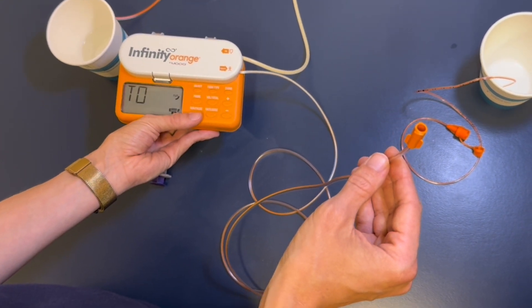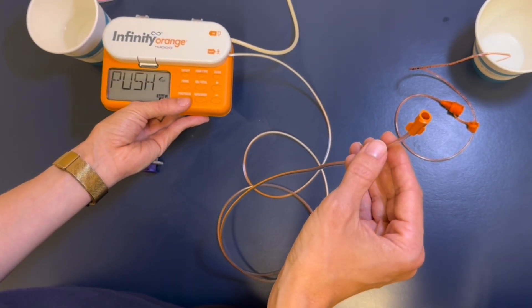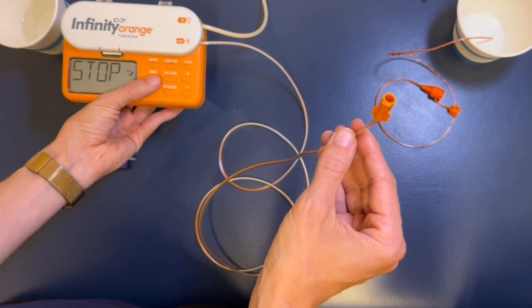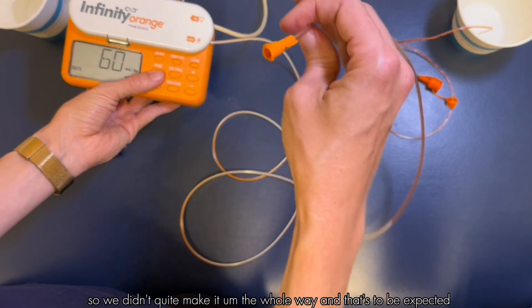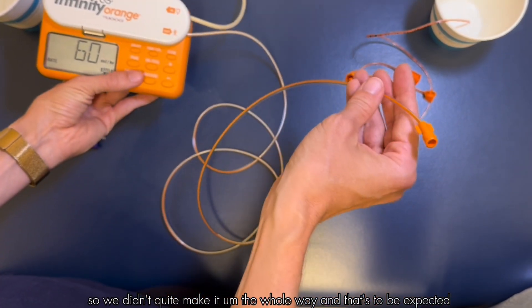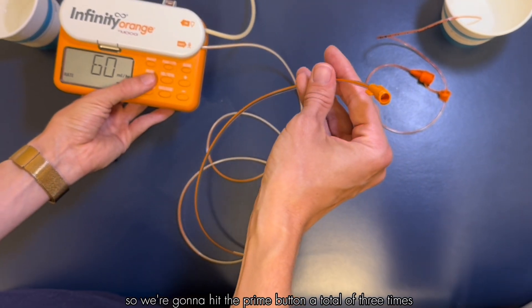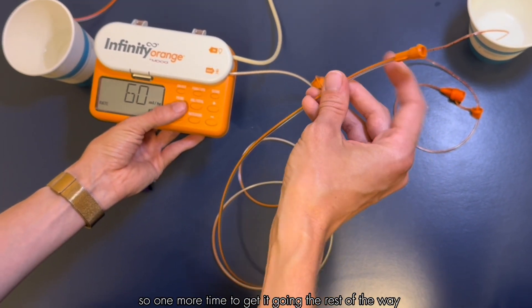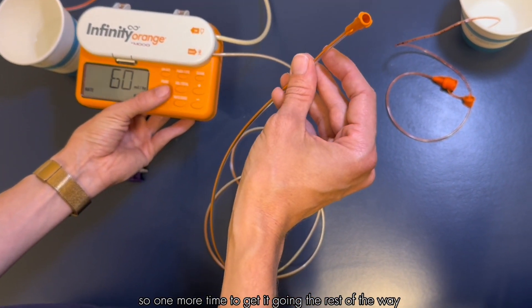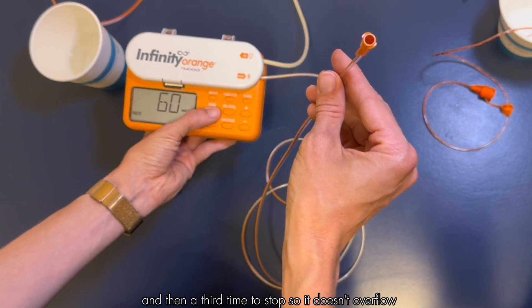And here it comes. So we didn't quite make it the whole way and that's to be expected. We're going to hit the prime button a total of three times. One more time to get it going the rest of the way and then a third time to stop so it doesn't overflow.